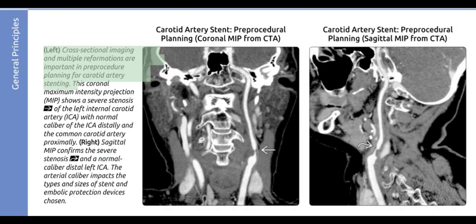Cross-sectional imaging and multiple reformations are important in pre-procedure planning for carotid artery stenting. This coronal maximum intensity projection shows a severe stenosis of the left internal carotid artery with normal caliber of the ICA distally and the common carotid artery proximally. Sagittal MIP confirms the severe stenosis and a normal caliber distal left ICA.